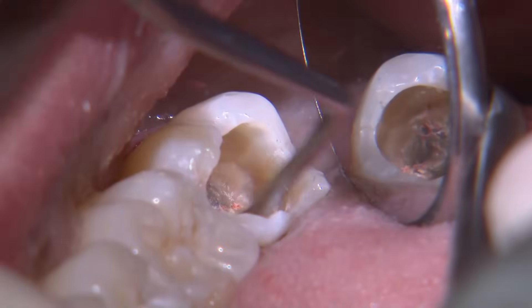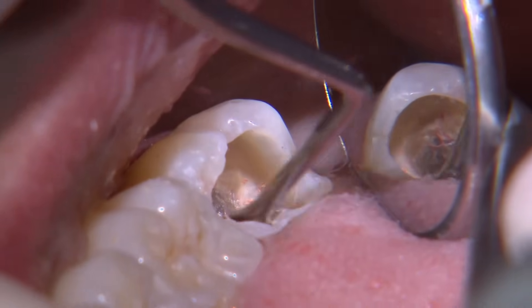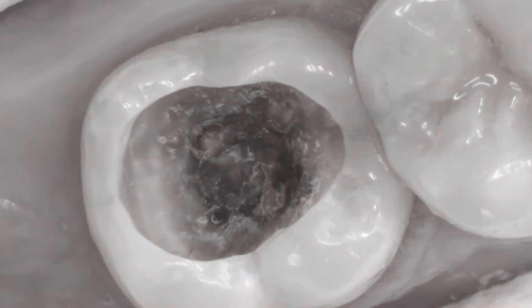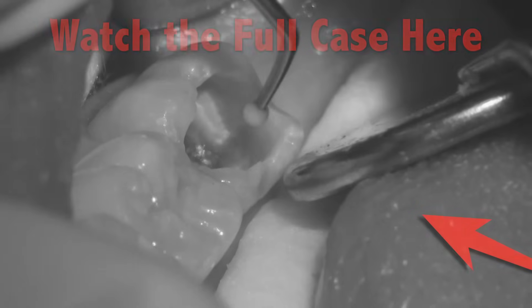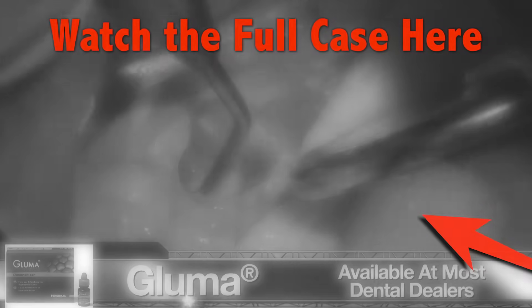At a depth of about four millimeters from the occlusal surface, I do begin to see the pulp horns. It's best to leave any affected dentin to avoid pulpal irritation and further complications. At this depth, I condition the cavity with polyacrylic acid for 20 seconds and then apply gluma for a minute.